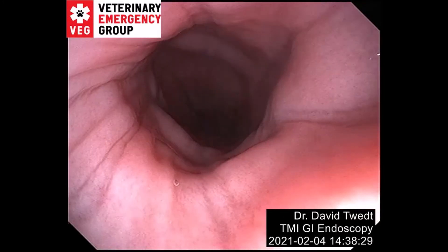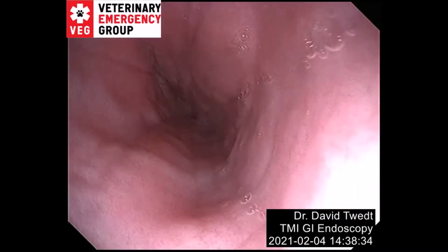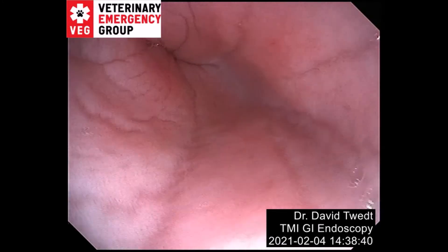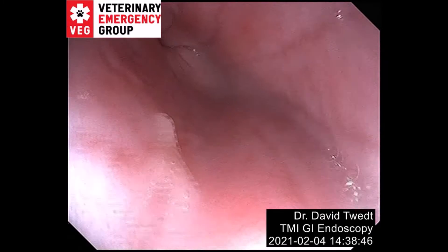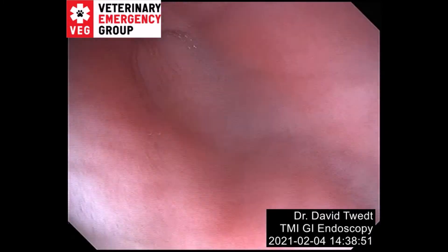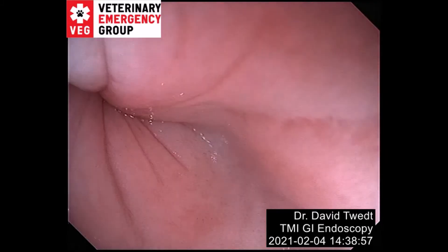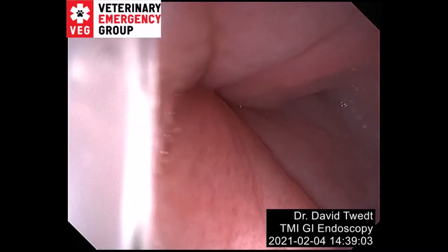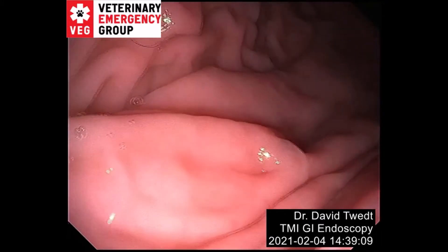Another place your skills will become very valuable is to show surgeons which side the aberrant vessel is in regurgitating puppies. So then getting this view of the lower esophageal sphincter — this is not a straight shot. A straight shot takes you again and again into that tissue. There's a slight left-hand turn to go through it. This sphincter only goes one place, so just push forward and you'll end up in the right place.